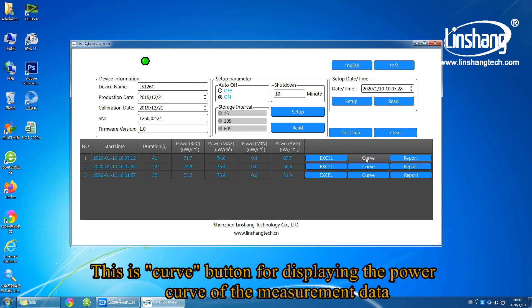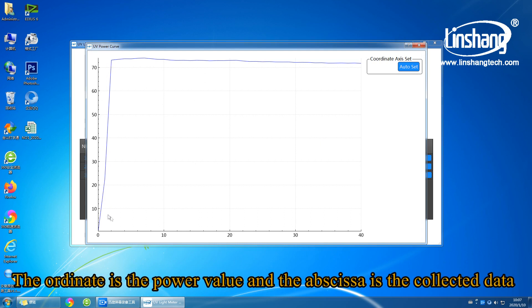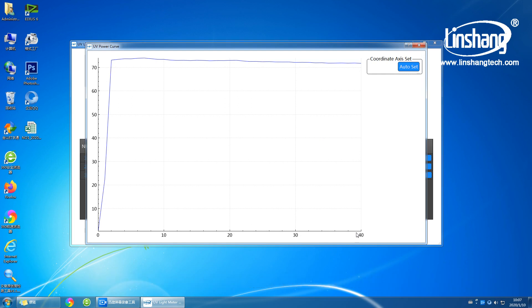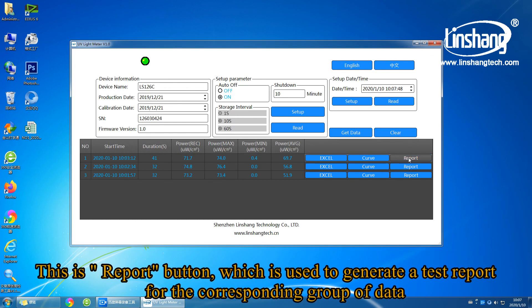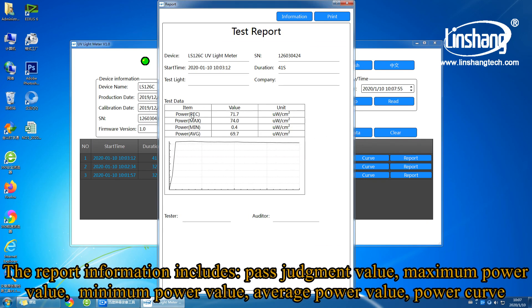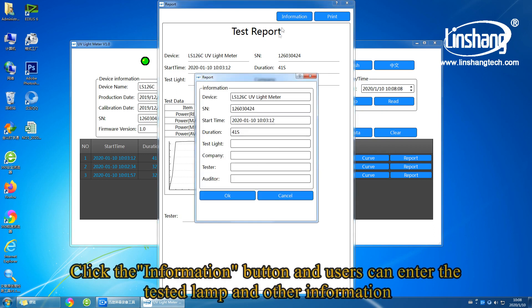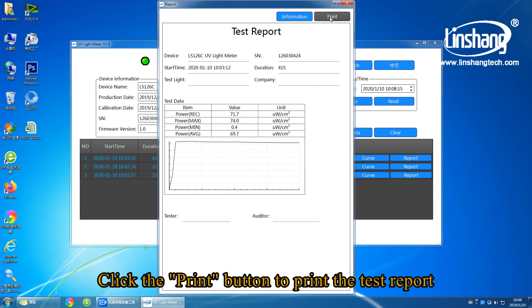This is the output button, which is used to generate a test report for the corresponding group of data. The report information includes pass judgment value, maximum power value, minimum power value, average power value, and power curve. Click the information button and users can enter the tested lab and other information. Click the print button to print the test report.